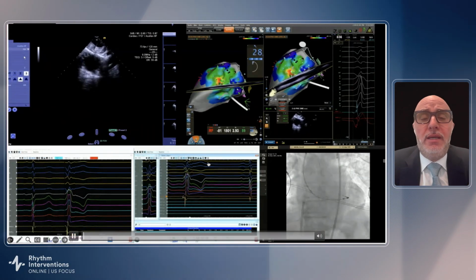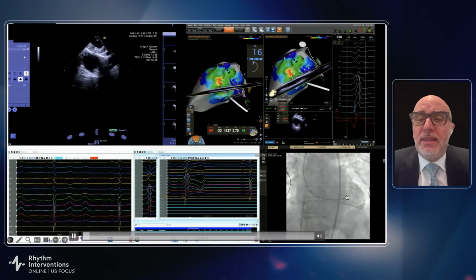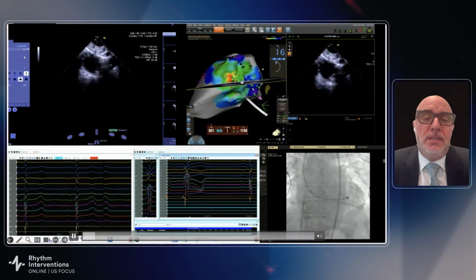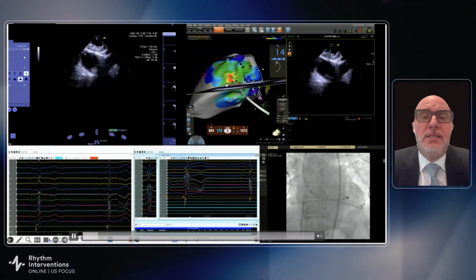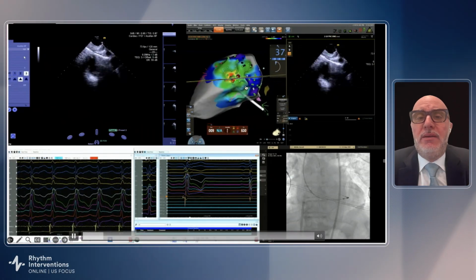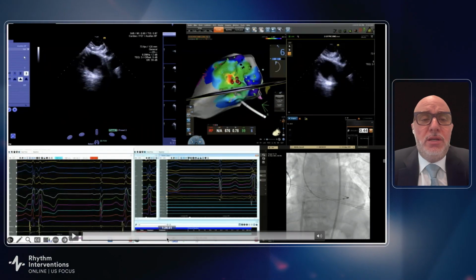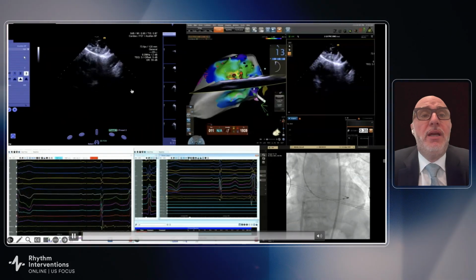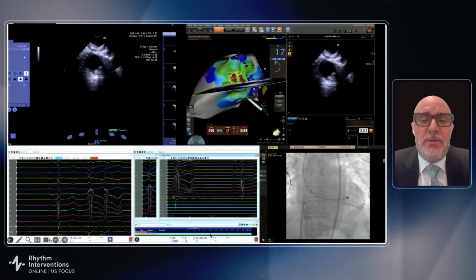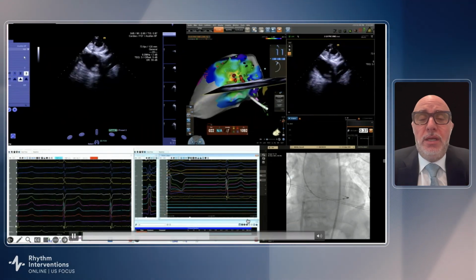So this is the setup for our case. This is live, as you know. In this case, we have a catheter going retrograde into the lateral left ventricle. This is the ICE view of this area, so you can see the image, and we have the catheter trying to get the best pace map and the best activation. What we could find was a bigger, wider area of activation. You can see that we performed several lesions in that area, all monitored by intracardiac echo. You can see the lesion formation, and we covered this area with radiofrequency, and we had no effect. The PVC continued at the end of those lesions; we didn't do anything.